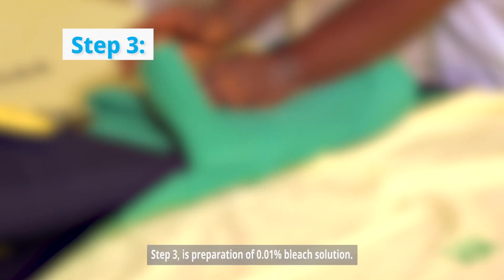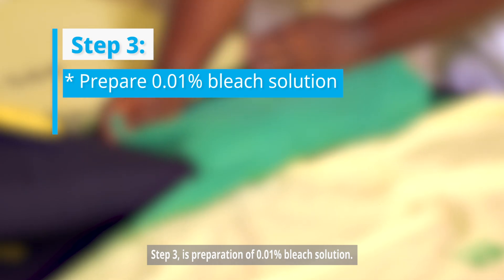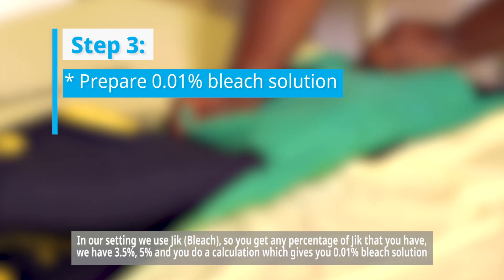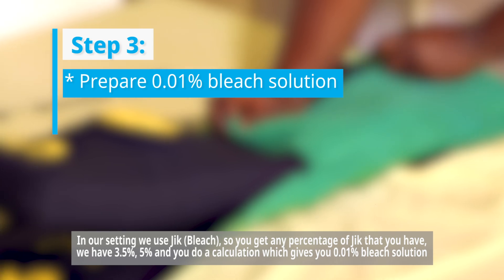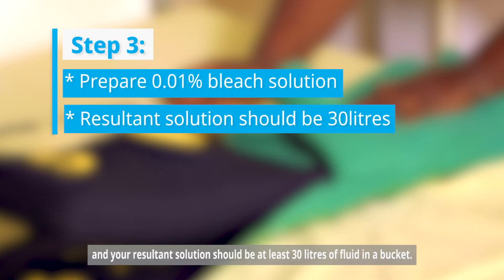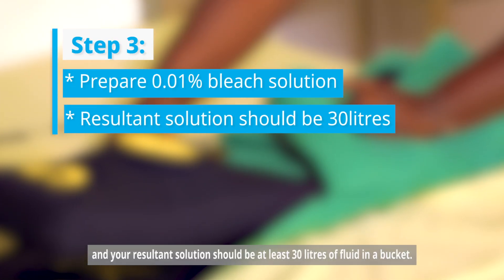Step number three is preparation of 0.01% bleach solution. In our setting, we use Jik. You get any percentage of Jik that you have — we have 3.5%, 5% — and you do a calculation which gives you a 0.01% bleach solution. Your resultant solution should be at least 30 liters of fluid in a bucket.